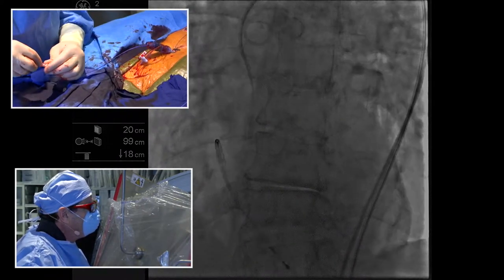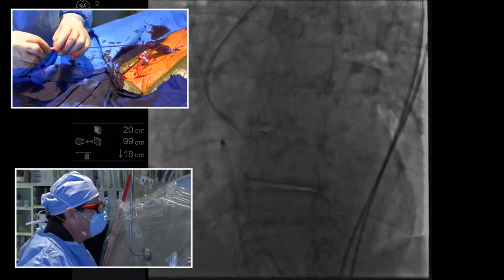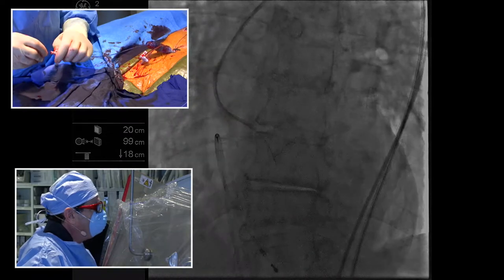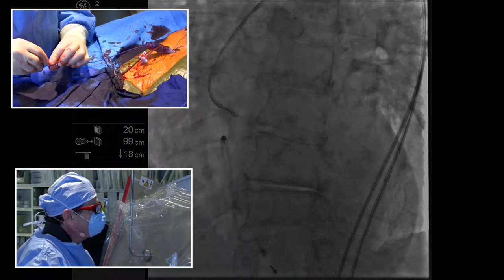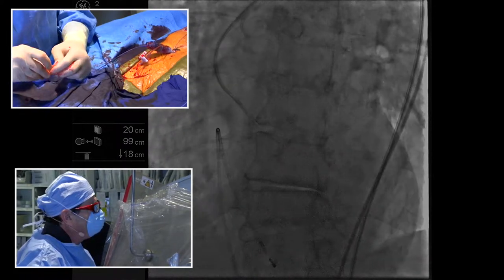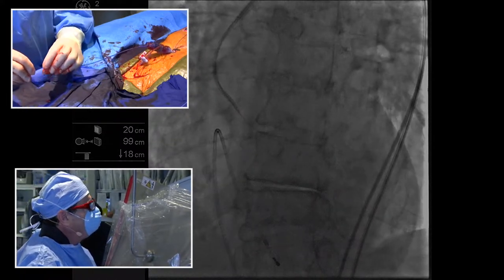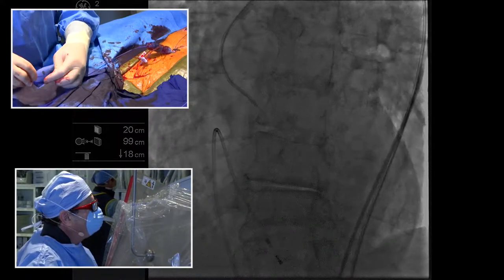Might help. Oh, this is really frustrating. Let's see, the other ones we've tried: multi-purpose, we've tried Lima's. I'm trying to think of what's going to be next. Has anybody seen any of our... so at this point I often go to our clinical specialists and sales guys and say, hey, what have you guys seen? Because you guys get to see a lot of these. What have you seen when people can't get through that works?